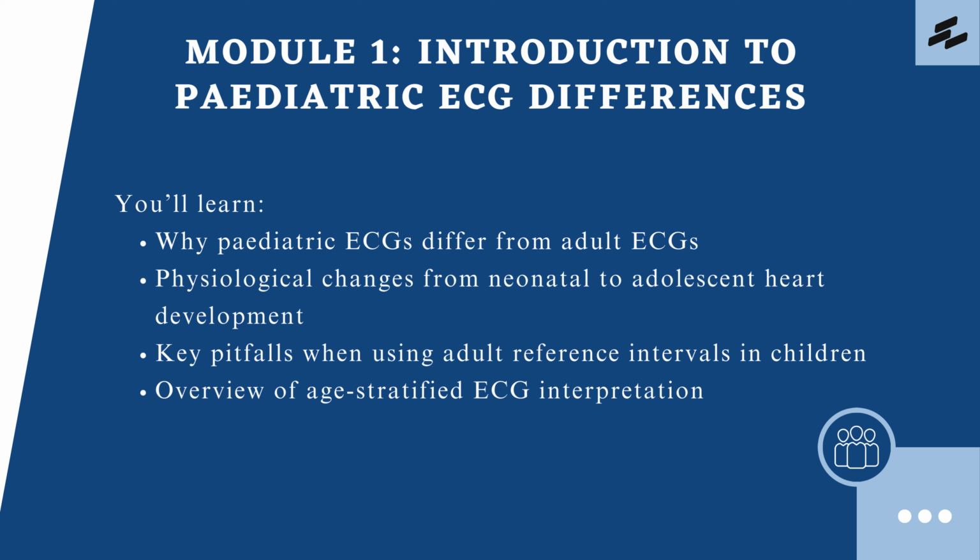We will also explore the common pitfalls of applying adult reference intervals to children's ECGs, which often leads to overdiagnosis of conditions like ventricular hypertrophy. This module provides an overview of age-stratified interpretation, setting the foundation for the detailed modules that follow.